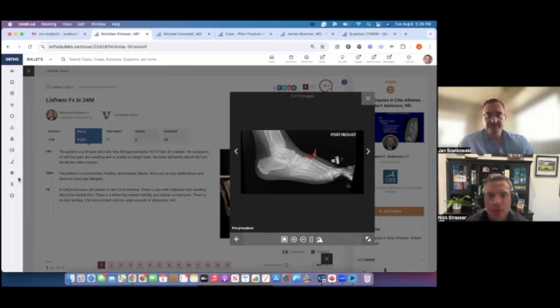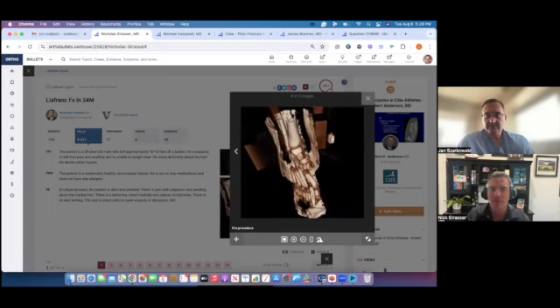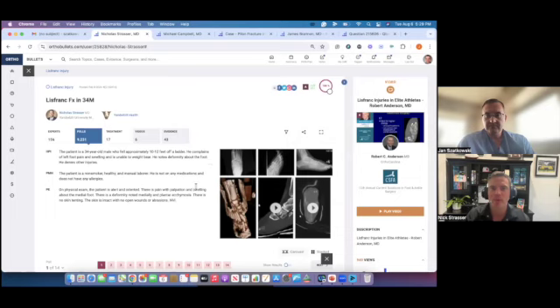Yep, completely agree. Okay, so dislocated, we said, hey, we're probably going to be taking this patient to the OR within the next probably 24 hours of the injury, for fixation or reduction and provisional pinning.